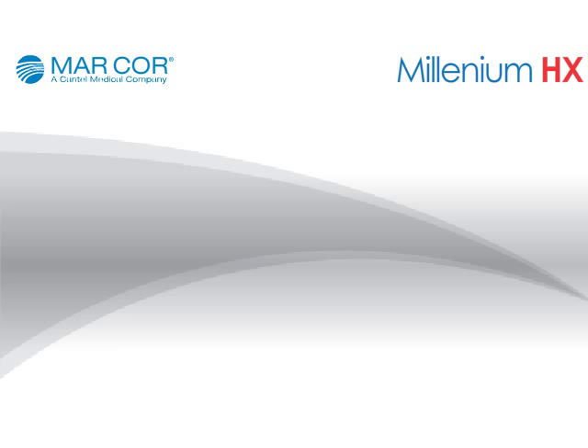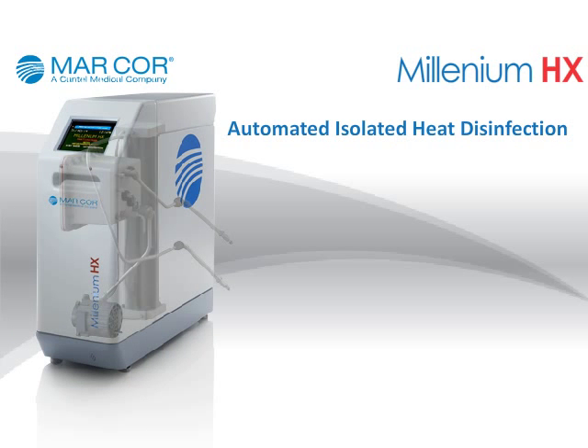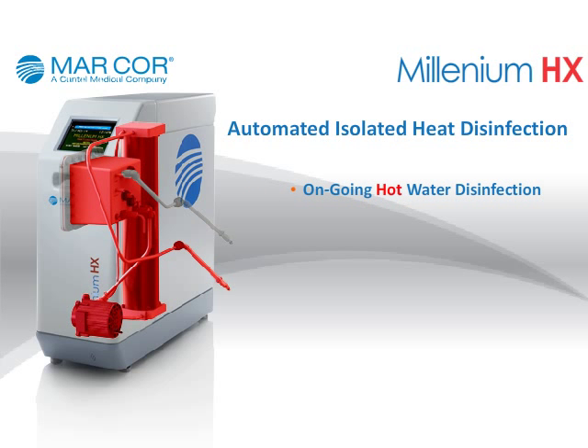Automated isolated heat disinfection: This unique system storage benefit delivers ongoing hot water disinfection cycles completely disconnected from a water source. It eliminates the possibility of an extensive water leak, yet provides on-demand operation.